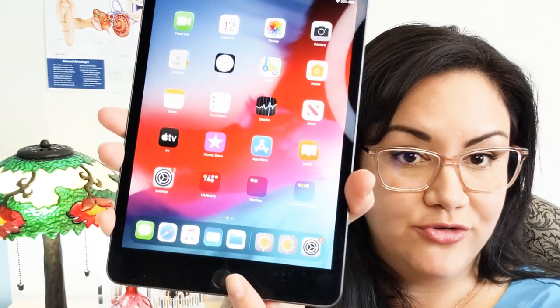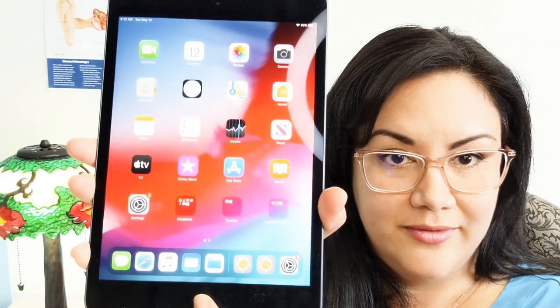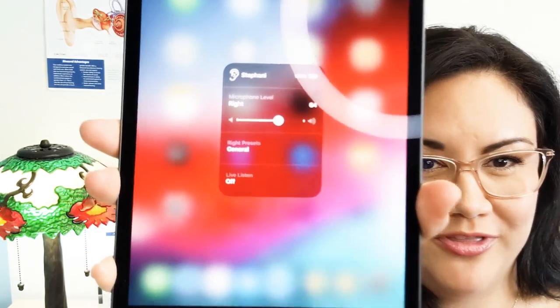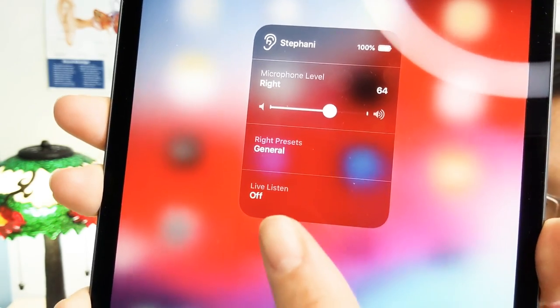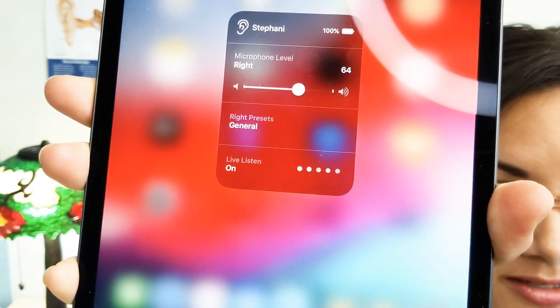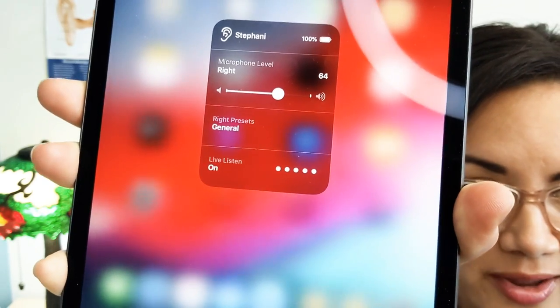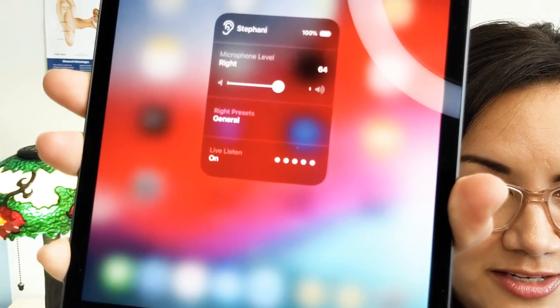Using this iPad, if I triple click here — triple click here — it will pop up with the hearing aid settings. This is the quick settings, and you'll see this little feature called Live Listen says off. But if you turn that on, you just need to be a little bit patient — it takes a couple seconds for it to say on. Then you'll see these little white lights start going, and if I stop talking they go off, so that is sensing my voice.